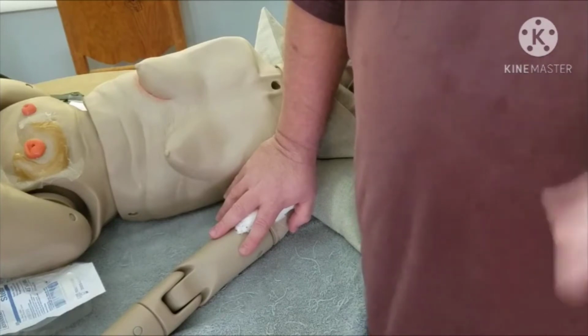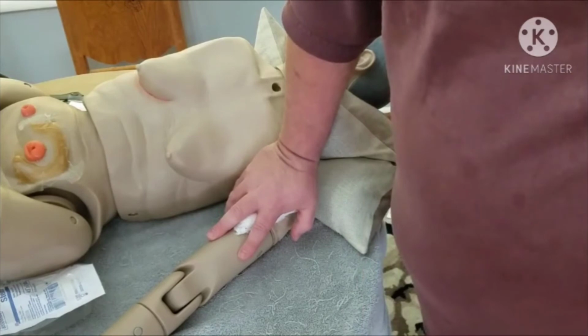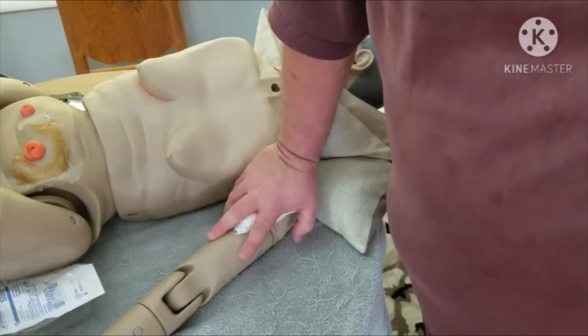for, if I was using hemostatic gauze, they have times on them. I think they say 3 minutes to 5 minutes. For gauze like this, I would hold a good 10-minute pressure on there. Just keep good, firm pressure down there.